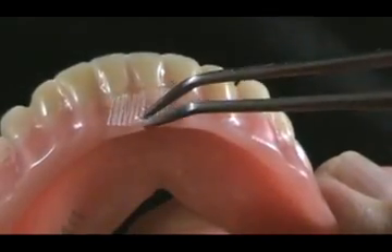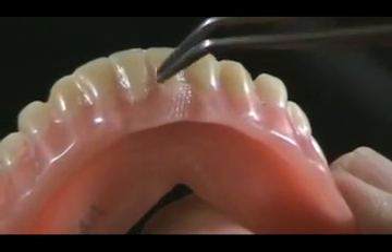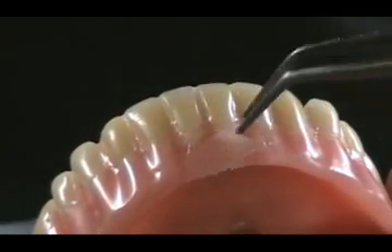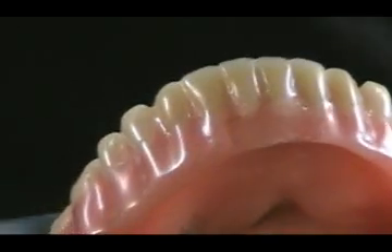Paint a small amount of self-cure monomer on the area to be repaired and reinforced. Pick up the wet Permamesh with cotton pliers and place the mesh in the area prepared for repair or reinforcement. Adapt the Permamesh to the contours of the denture.